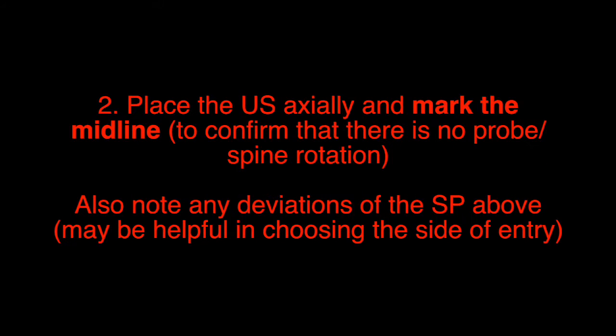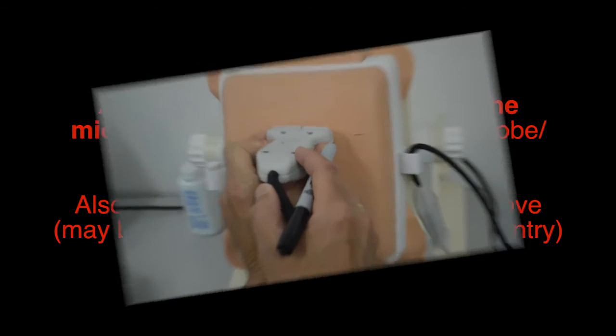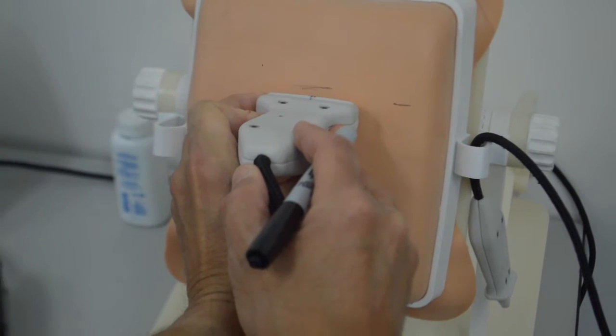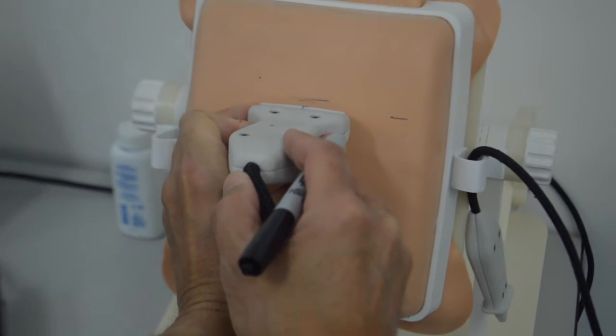Step 2: Place the ultrasound axially and mark the midline to confirm that there is no probe or spine rotation. Also, note any deviations of the spinous process above. This may be helpful in choosing the side of entry. Here, we are placing the probe axially and marking the midline.